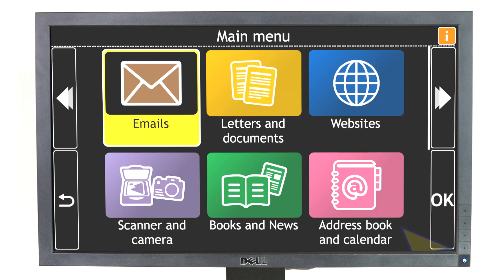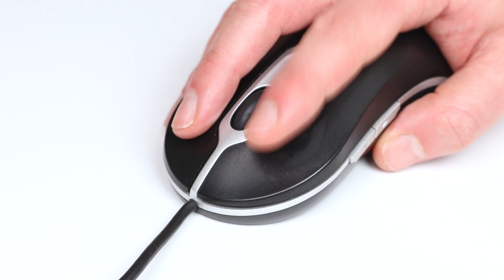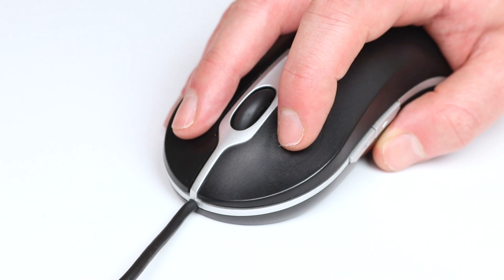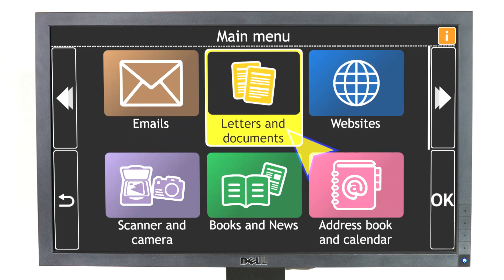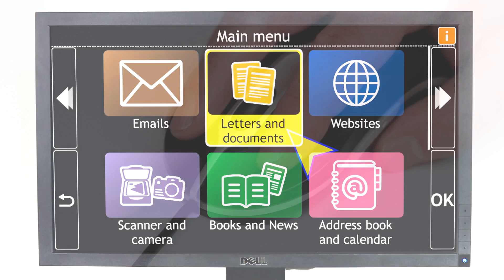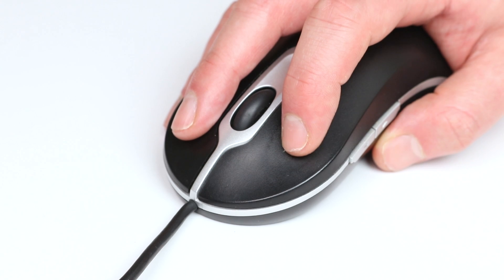If you prefer to use the mouse, simply move the mouse pointer over an item. Click once to have the item read aloud. Letters and Documents, 2 of 10. And click twice to open the item.